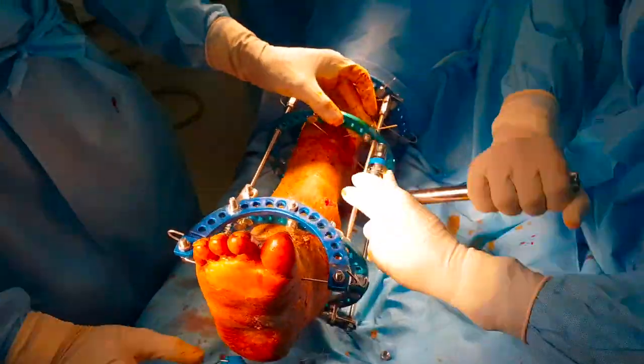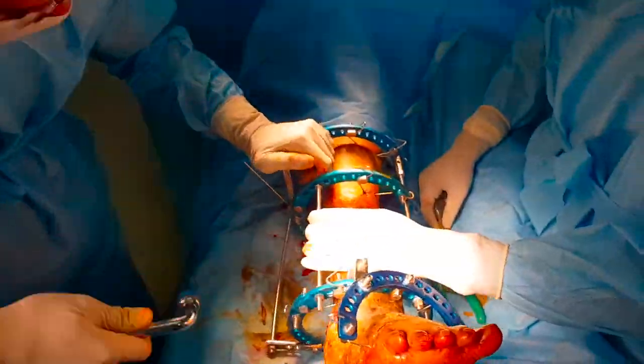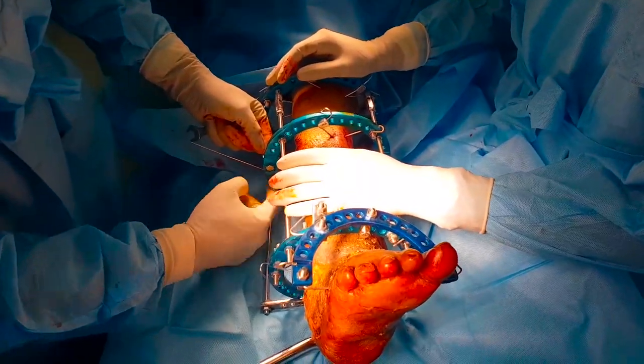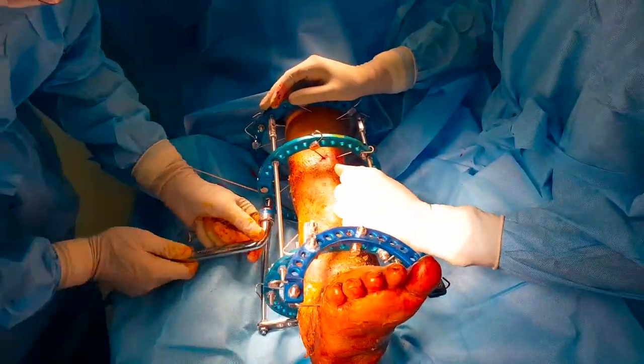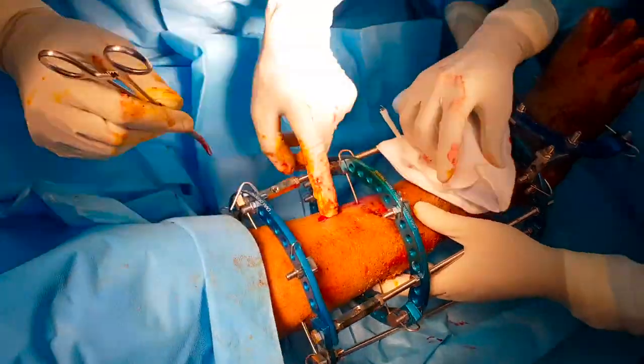We now have three wires in the distal segment, three wires in the proximal segment, and two wires in the middle segment. Ideally, in a three-ring construct, we would require nine Kirschner wires.